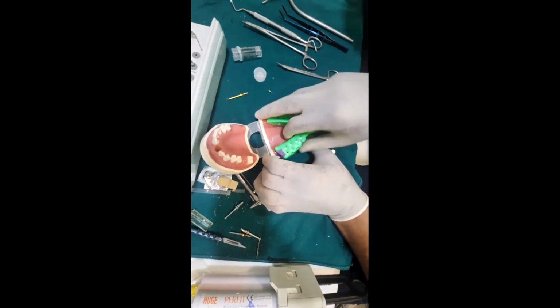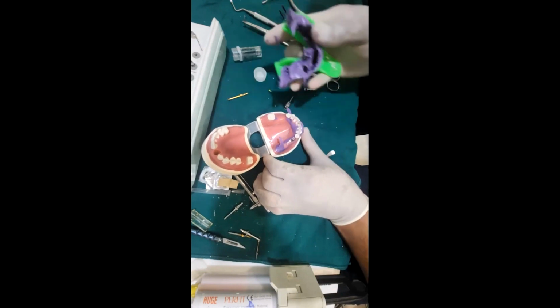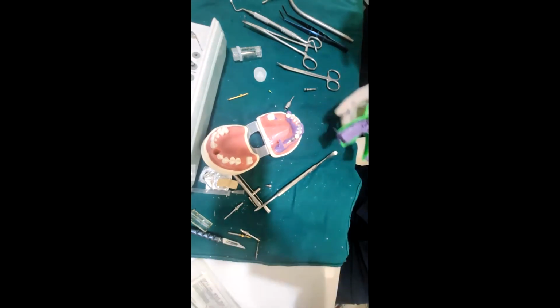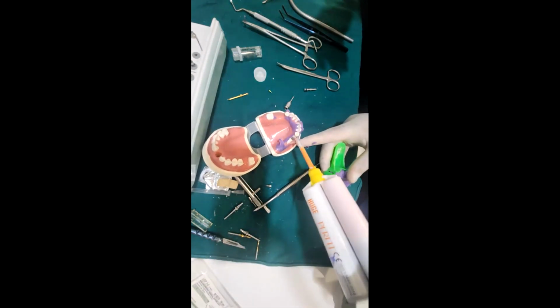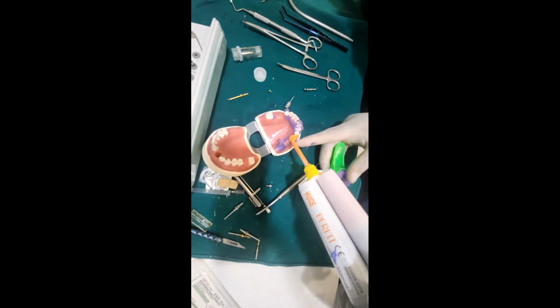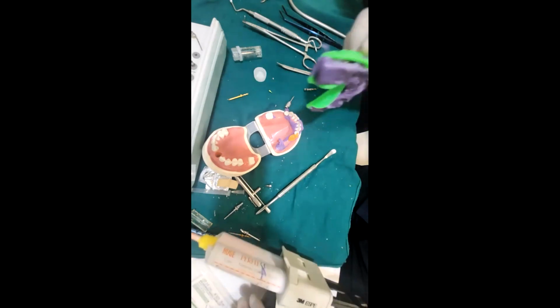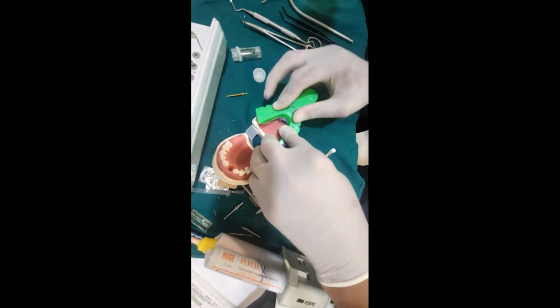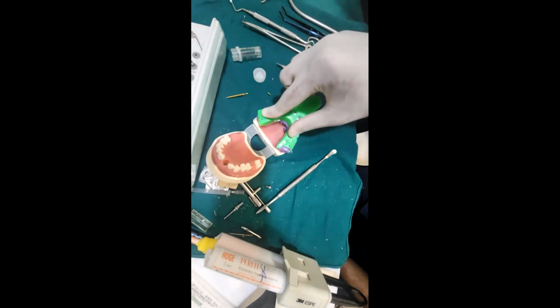And remove this. It's sticking because the model is a silicon thing. You use the light body around the implant impression coping, and you make an impression.